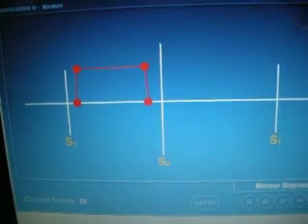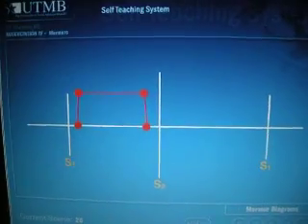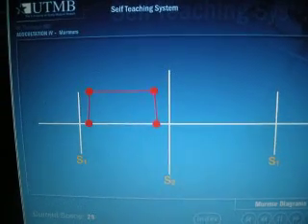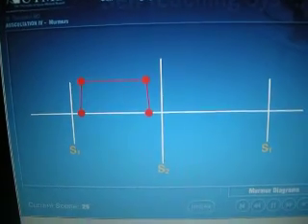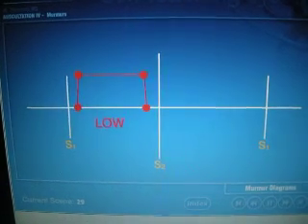In a few cases, the profile is complex or curvilinear, and simple dot profiling won't work. Finally, we need to show the pitch on the diagram, and this can be indicated by either fine or coarse lines, or words for low or high-pitched murmurs.